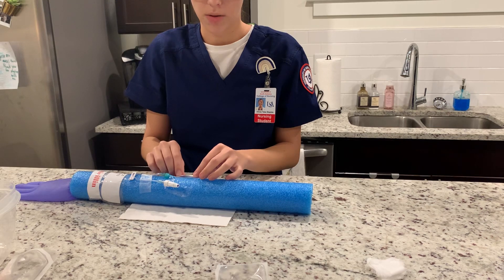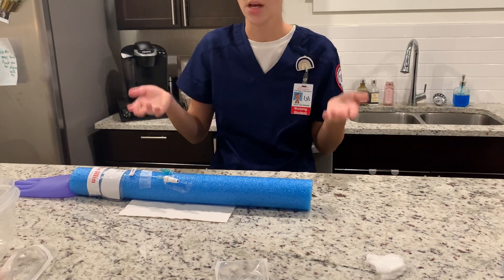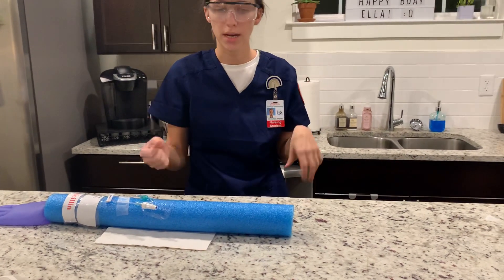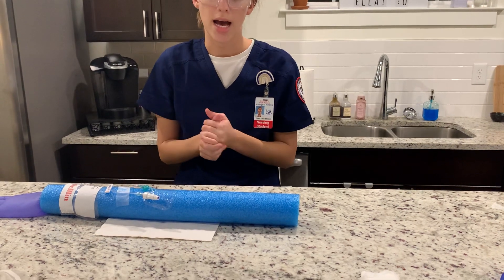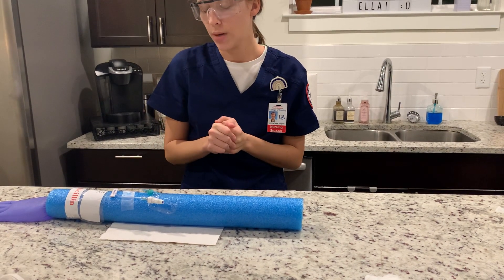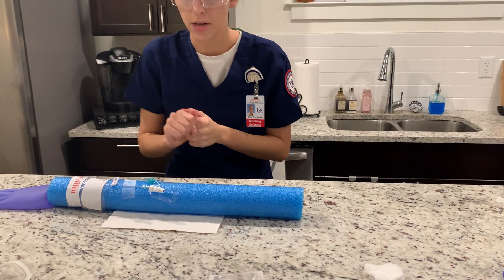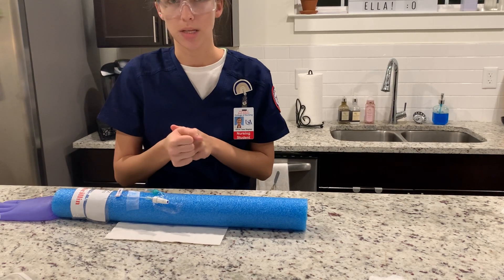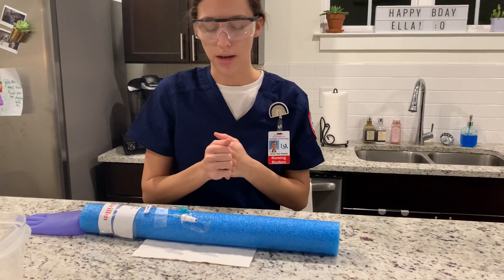I'm going to lower the bed, raise the side rails, and make sure the patient is comfortable and safe. I'm going to instruct the patient on the correct things to do if the IV is dislodging to prevent that, as well as the signs and symptoms of IV complications.